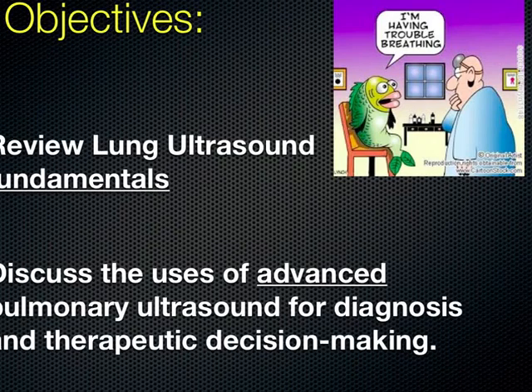The objectives of today's discussion will be to review the lung ultrasound fundamentals that we just mentioned. We will also look at ways we can use pulmonary ultrasound and pleural ultrasound to advance our diagnostic skills at the bedside.